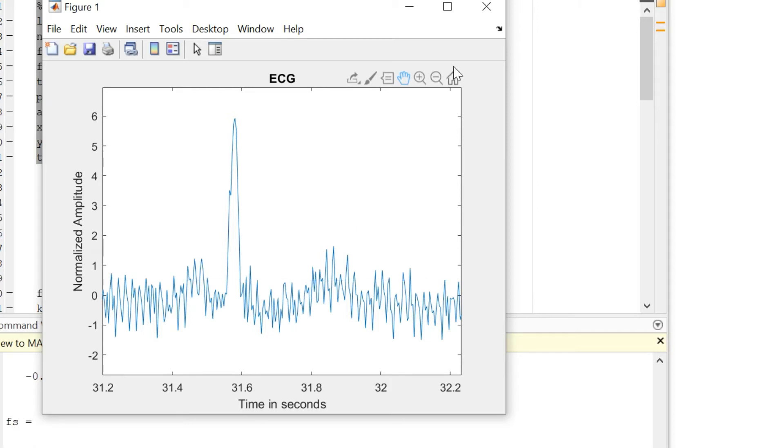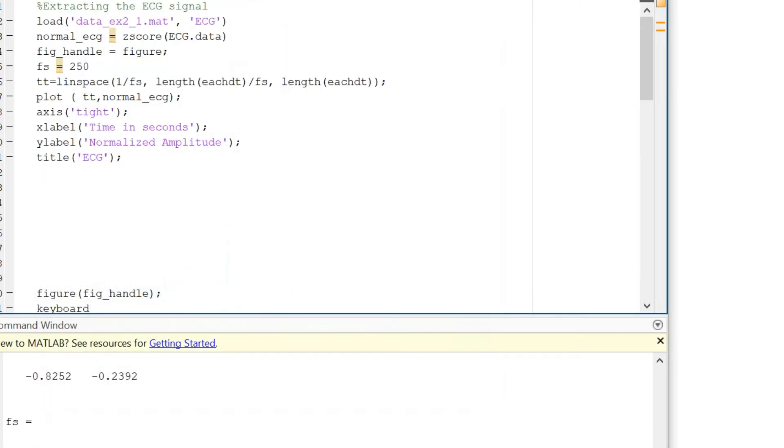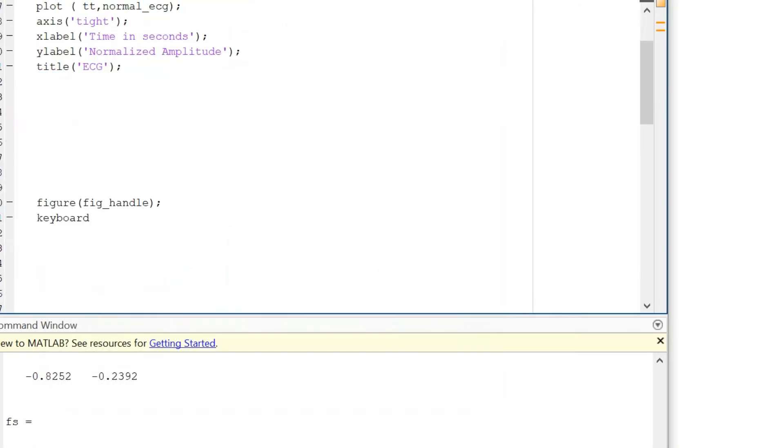Anyway, we can move on to the next few lines of code which are pretty important. First, we will call the figure fig_handle and we will write this particular function called keyboard.